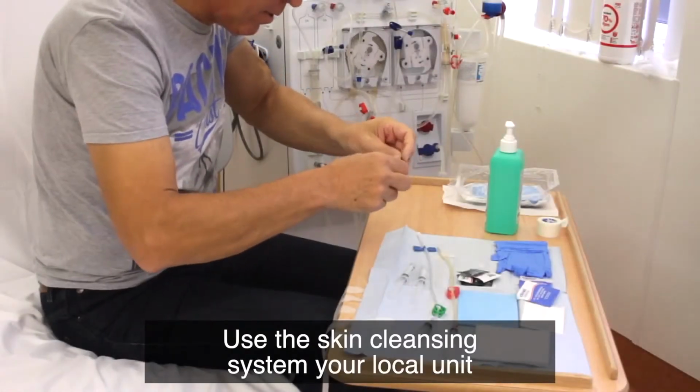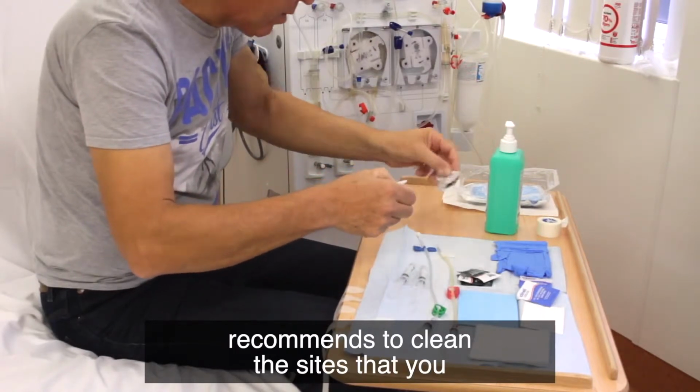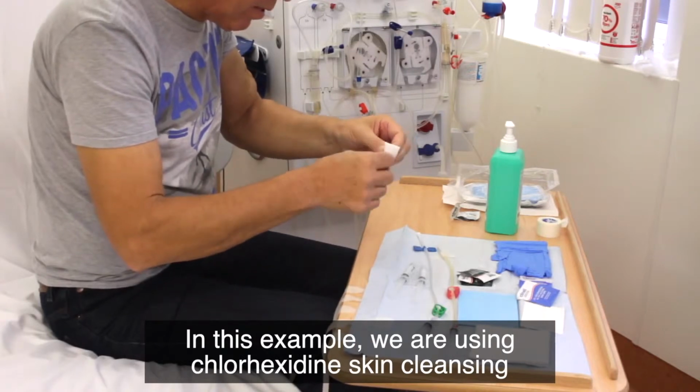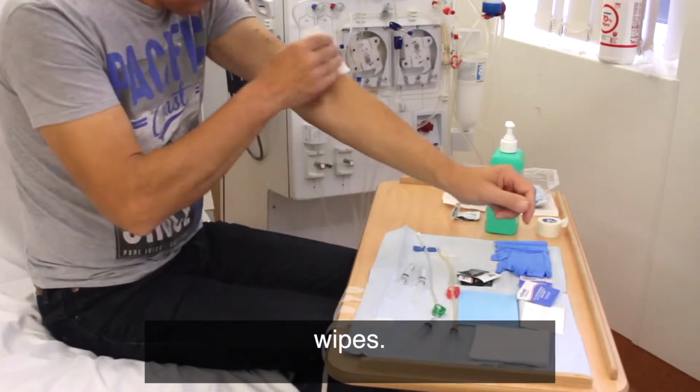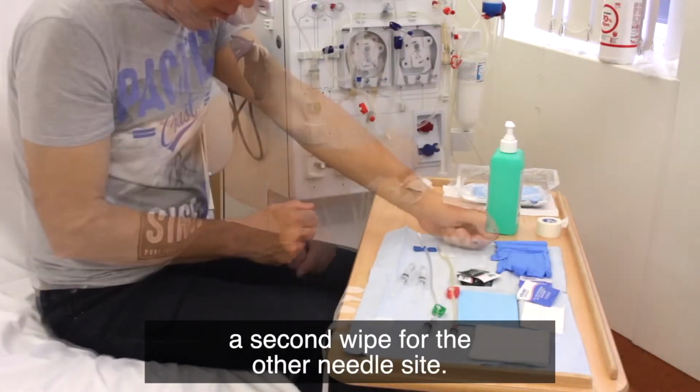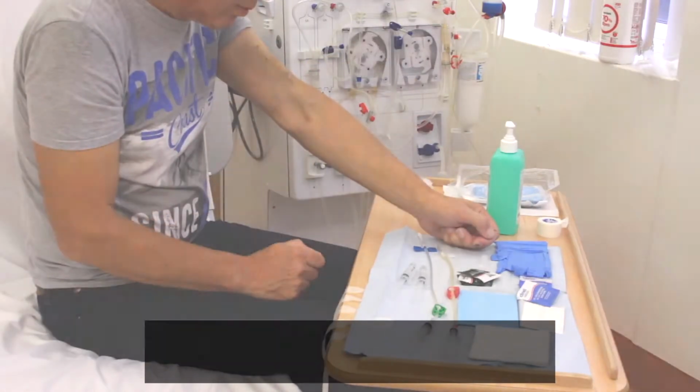Use the skin cleansing system your local unit recommends to clean the sites that you have chosen for dialysis. In this example, we are using chlorhexidine skin cleansing wipes. Clean with a single swipe and use a second wipe for the other needle site. Wait for the sites to dry.